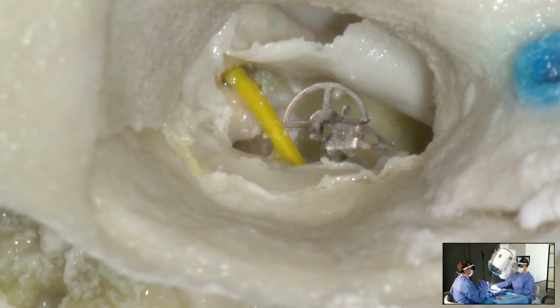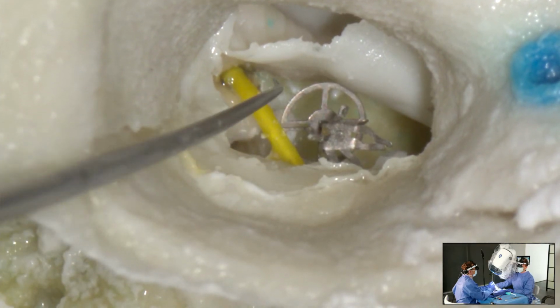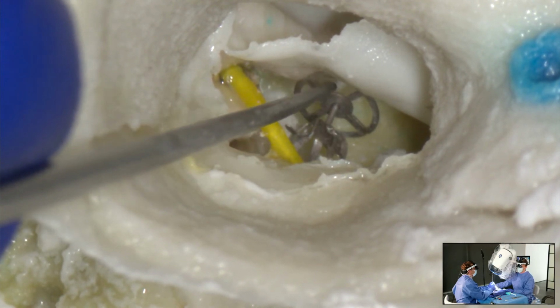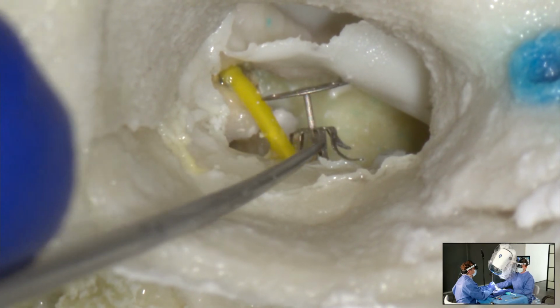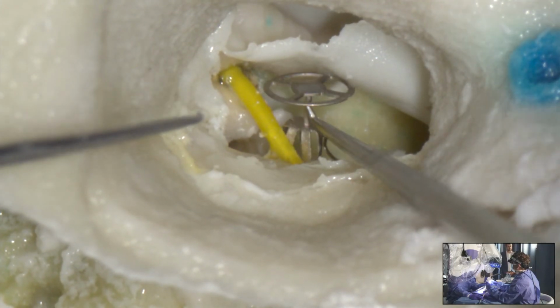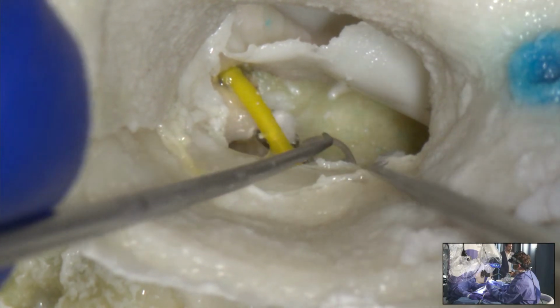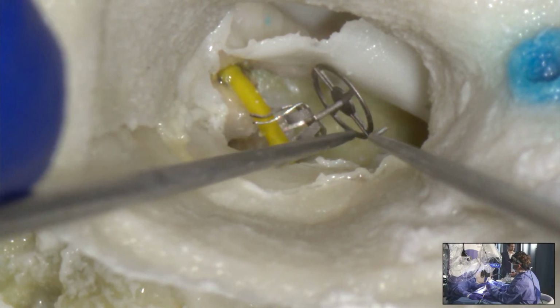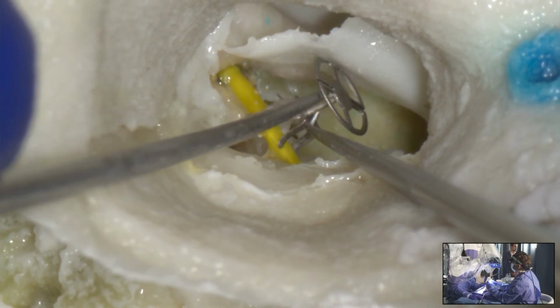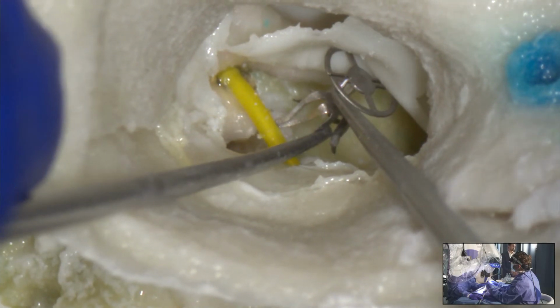So what I did before, I tried to fix the prosthesis on the stapes once before, and it's very hard with this floppy eardrum here, because the eardrum always pushes my prosthesis into a wrong position. So I'm sorry for the delay now. It's not 100% a real case, this is not done on real patients but on artificial bones, but it perfectly demonstrates how you can handle this type of procedure when having implant material or transplant material and preparing it on the side table, and how fast you can switch between those two positions and what the advantages are.